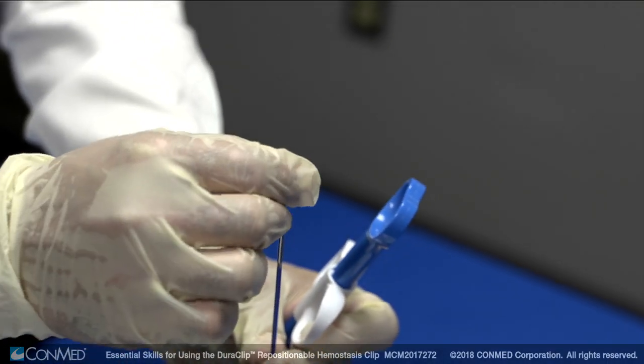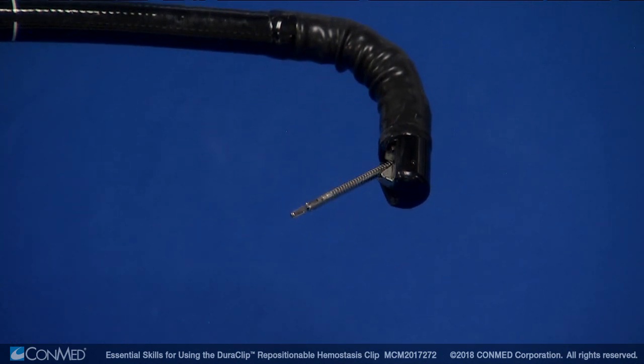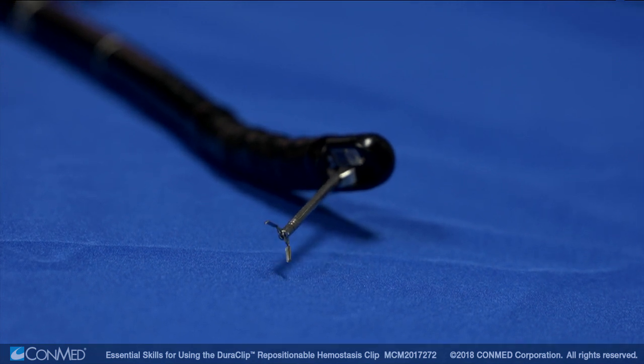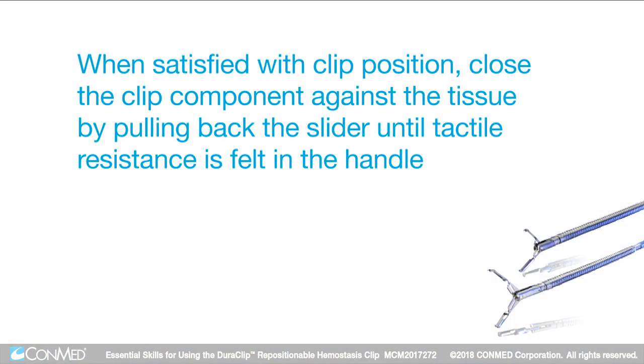After removing the protective sleeve, carefully insert the device into the endoscope channel, ensuring that the clip is in the closed position. Open the clip by pushing the slider forward. The clip can be rotated clockwise or counterclockwise depending on the position that is trying to be achieved. When satisfied with the clip position, close the clip component against the tissue by pulling back the slider until tactile resistance is felt in the handle.